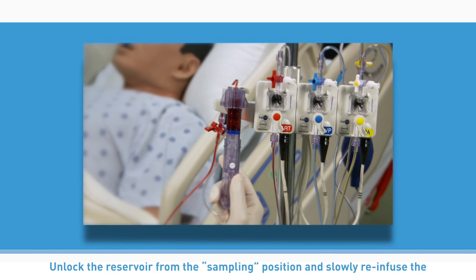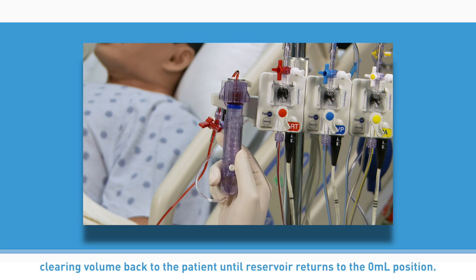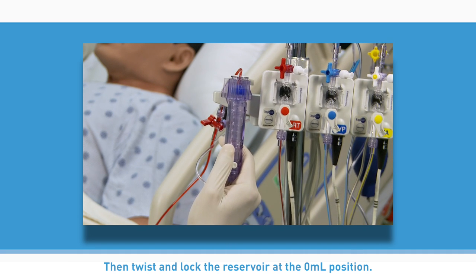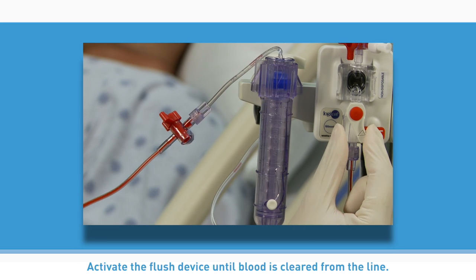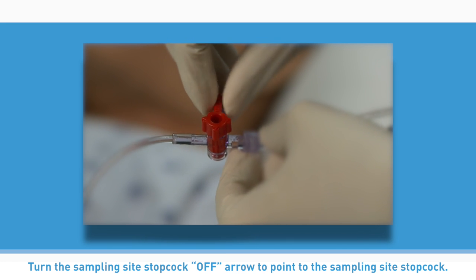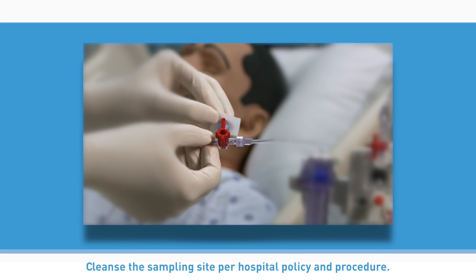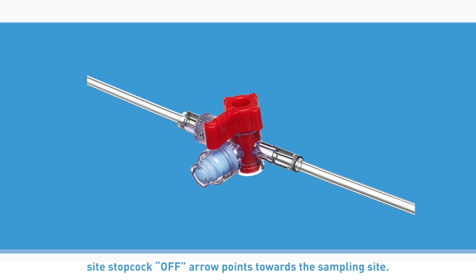Unlock the reservoir from the sampling position and slowly re-infuse the clearing volume back to the patient until the reservoir returns to the zero milliliter position. Then twist and lock the reservoir at the zero milliliter position. Activate the flush device until blood is cleared from the line — short flushes may clear the line better. Turn the sampling site stopcock off arrow to point to the sampling site stopcock. Cleanse the sampling site per hospital policy and procedure. Note: when monitoring patient blood pressure, ensure the distal sampling site stopcock off arrow points towards the sampling site.